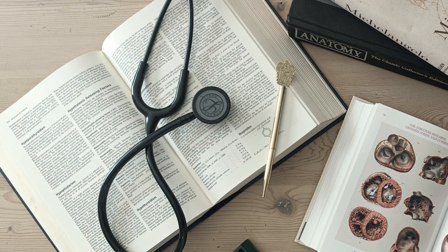This is when some impulses from the atria don't even make it through the AV node to the ventricles. Indeed. In second-degree heart block, some SA nodal impulses successfully penetrate the AV node and reach the ventricles, but others fail to conduct completely. There are two distinct types you absolutely need to recognize on the ECG, Mobitz type 1 and Mobitz type 2. They have very different implications and underlying pathology.